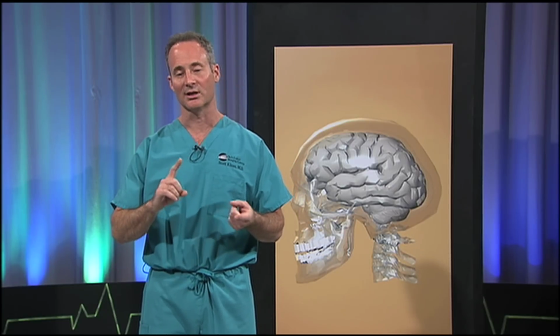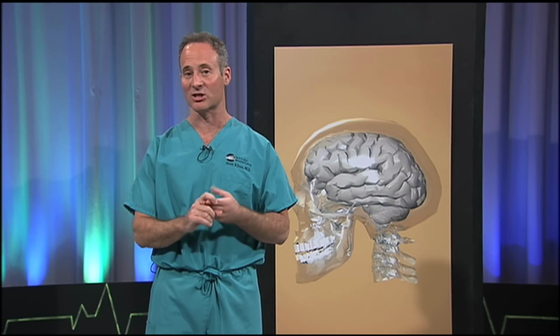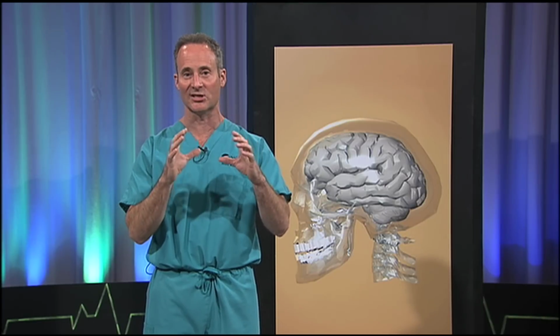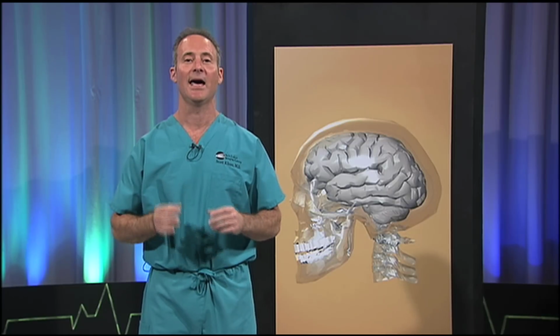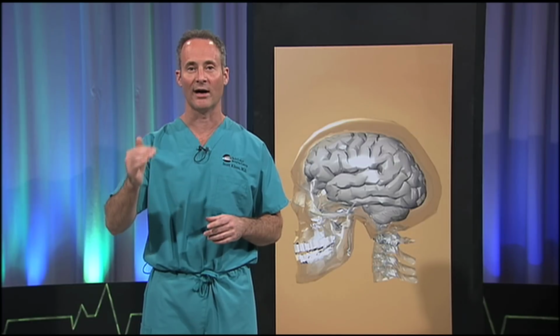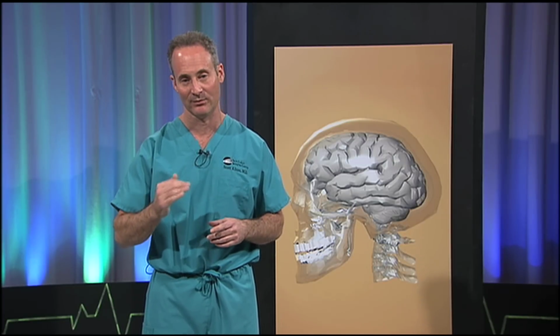Because it was a remote machine and it was programmed in Fortran, it took about 20 minutes to produce a single image, not the whole image of the brain, but just one slice through the brain. After the computer was moved on site and programmed in a machine language, that time to acquire and reproduce that image was reduced to approximately 5 minutes.